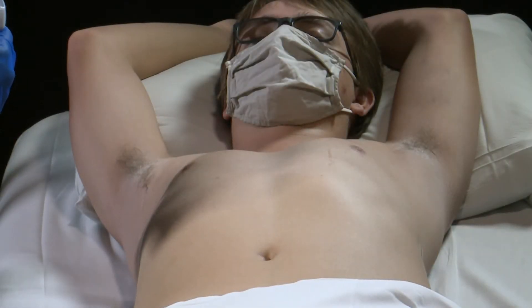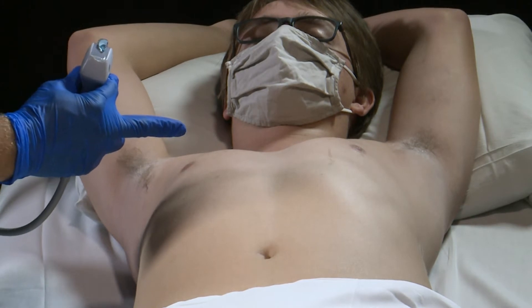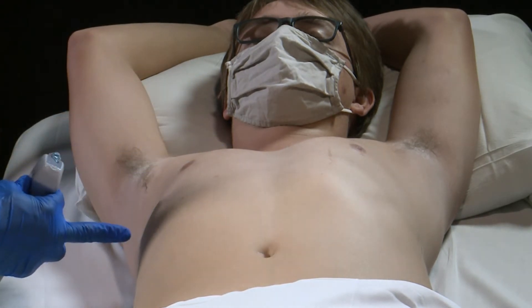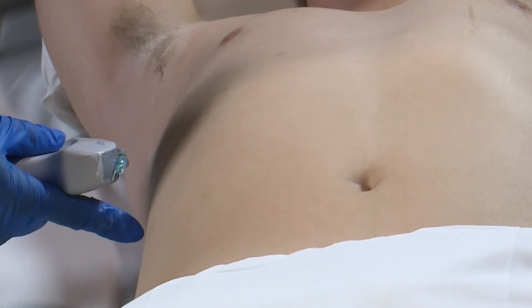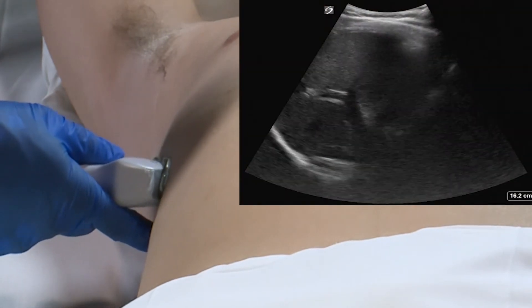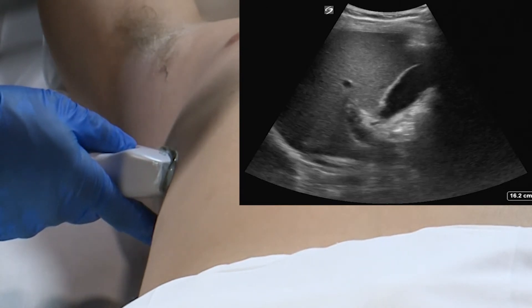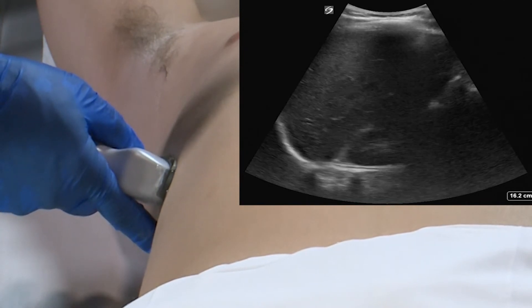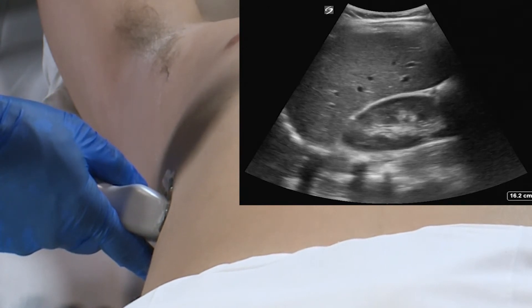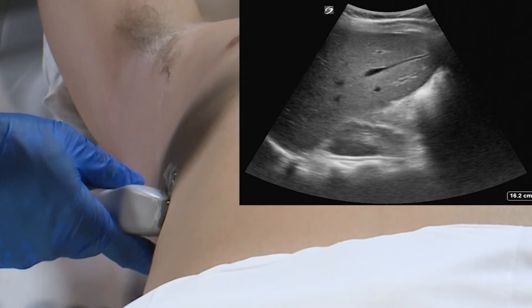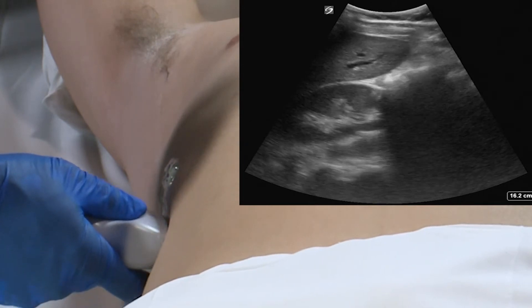For the right upper quadrant view of the FAST exam, we're going to place our transducer where the imaginary lines of the xiphoid process and the mid-axillary line intersect. Our marker dot is going to be pointed towards the patient's head. To look down into Morrison's pouch, or the hepatorenal fossa, we're going to need to tilt the transducer down, aiming towards the kidney and into this potential space. In order to see small amounts of fluid, we'll need to move the transducer over several different intercostal spaces.